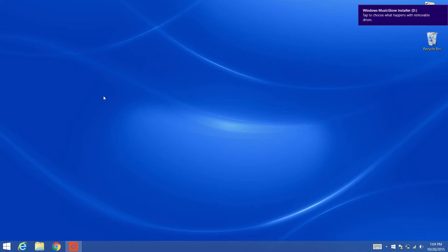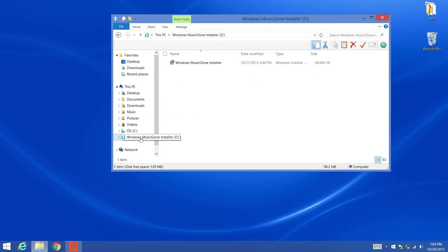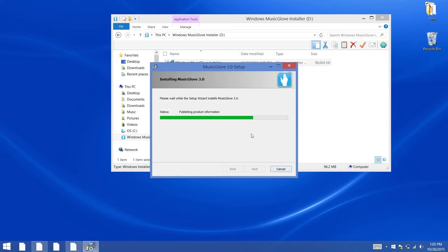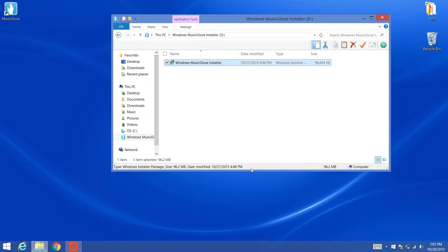If you are using a Windows computer, click on the Windows Explorer icon on your taskbar and click on MusicGlove USB Drive. Next, double-click on Windows MusicGlove installer. Click on the checkbox after reading the terms in the license agreement and click Install. Once the installation is complete, click Finish to complete the setup.